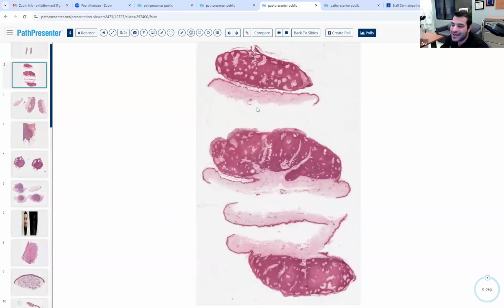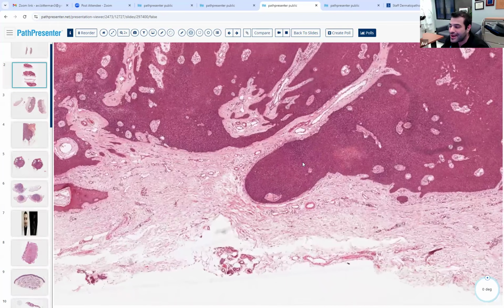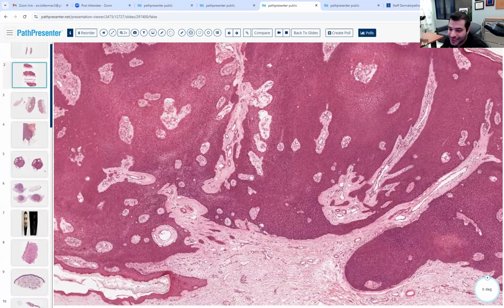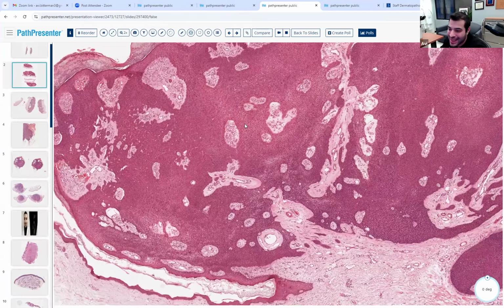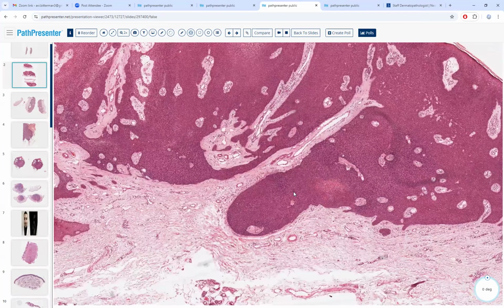But this is clearly not, right? This is clearly going into the dermis. So it can't be a hydroacanthoma simplex. We have to call it something else. So what are our options? It's like poroma, dermal duct tumor, and hydroacanthoma. So this is dermal duct tumor.